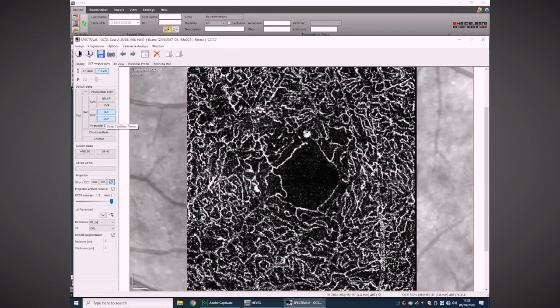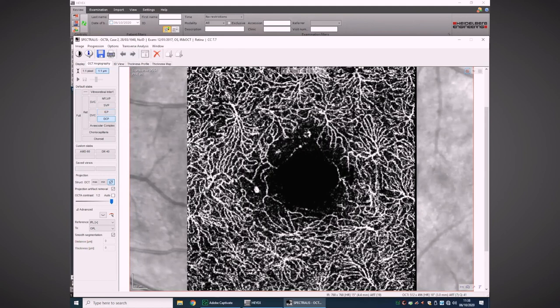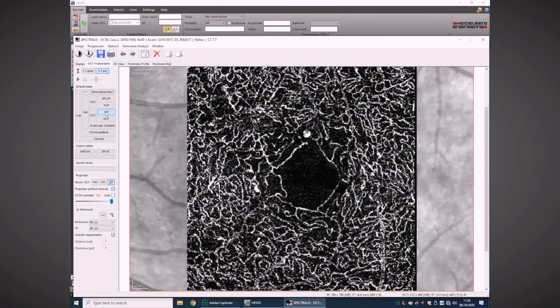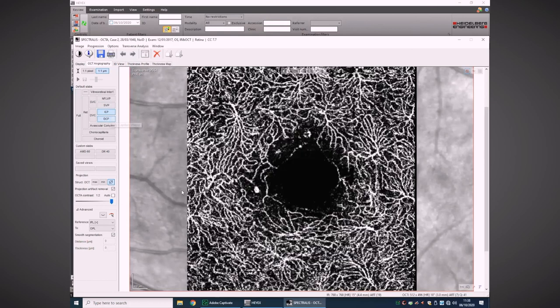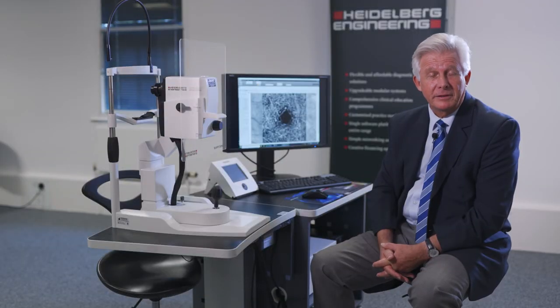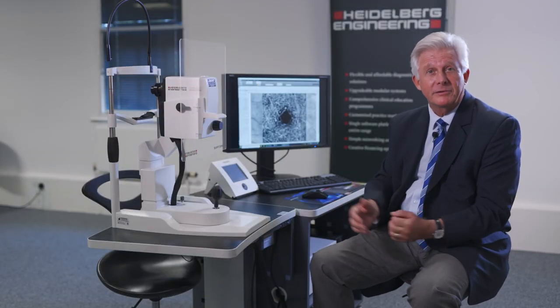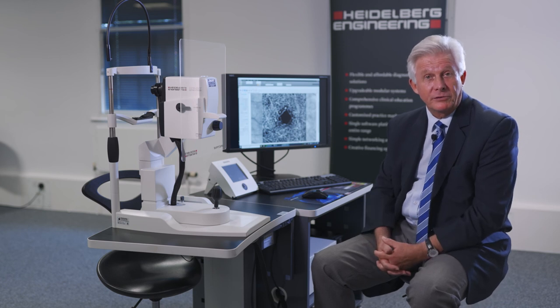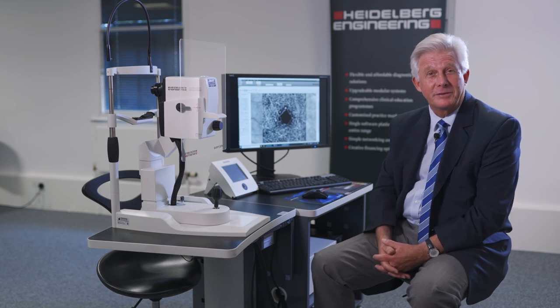Magnifying the image, you can see the configuration of the capillaries in the combined complex, but we can also separate the plexus. Here is the intermediate capillary plexus, where you can see much more separated spaces between the capillaries and evaluate the foveal vascular zone — monitoring whether there are changes indicative of early diabetic changes. Moving to the deep capillary plexus, you see a much more dense mosaic of capillary structures compared to the intermediate. You can flick between those separate plexus to evaluate what is happening, rather than looking at the combined vascular complex — it may be important to identify separate changes in each plexus.